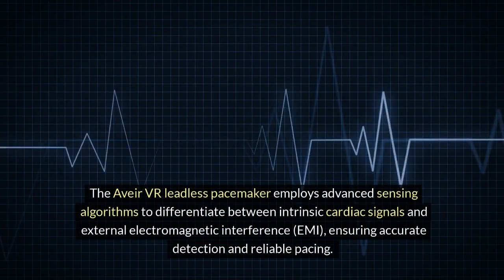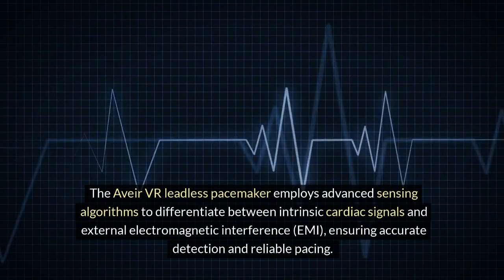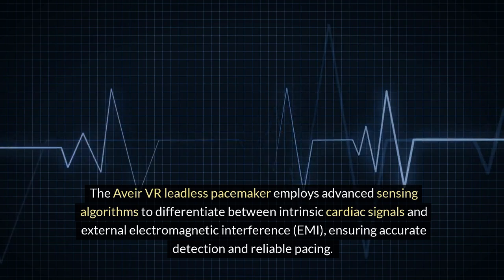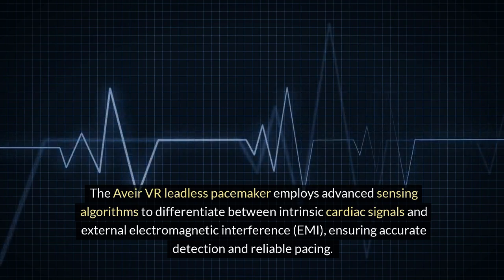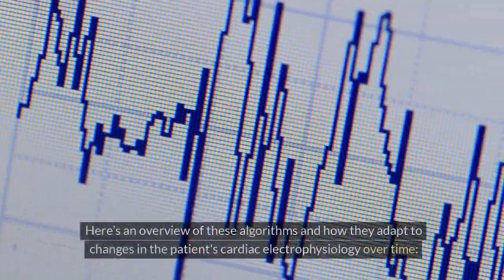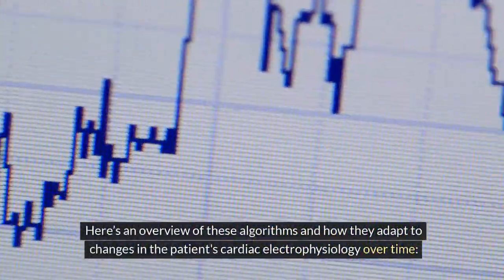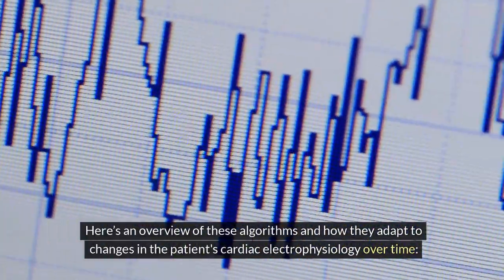GPT-4o answer. The Aveir VR leadless pacemaker employs advanced sensing algorithms to differentiate between intrinsic cardiac signals and external electromagnetic interference (EMI), ensuring accurate detection and reliable pacing. Here's an overview of these algorithms and how they adapt to changes in the patient's cardiac electrophysiology over time.